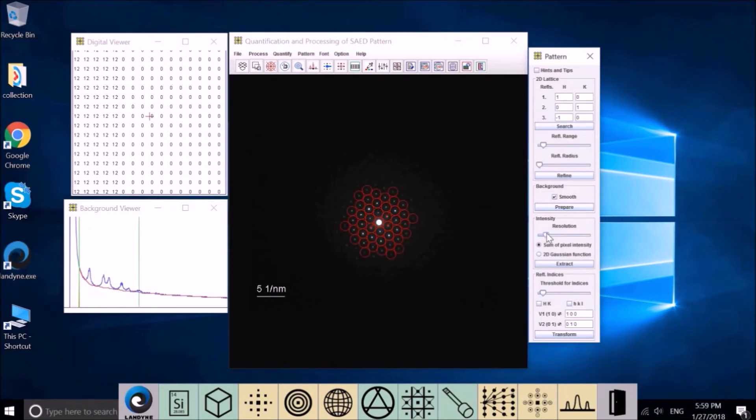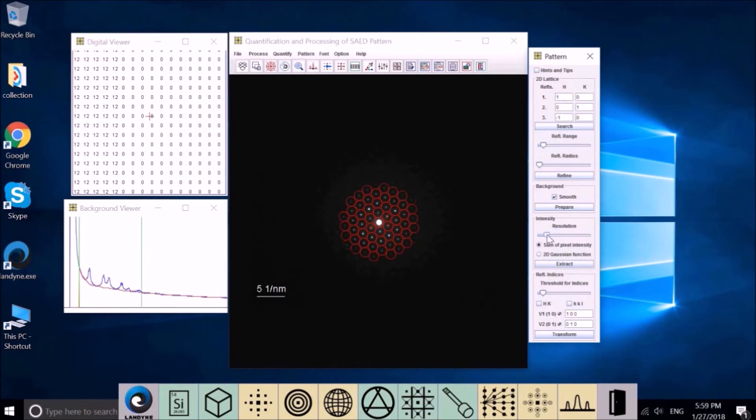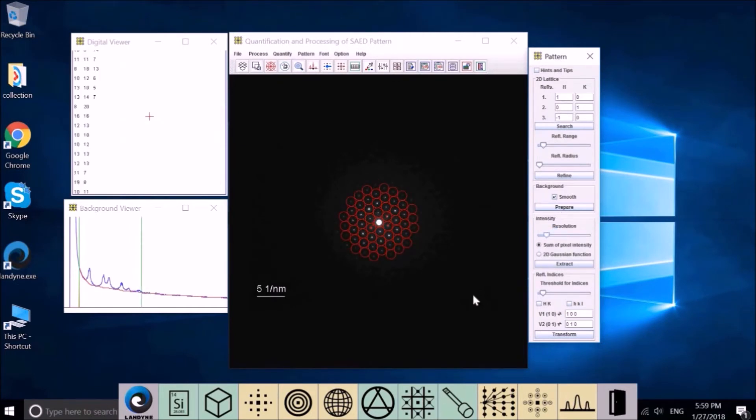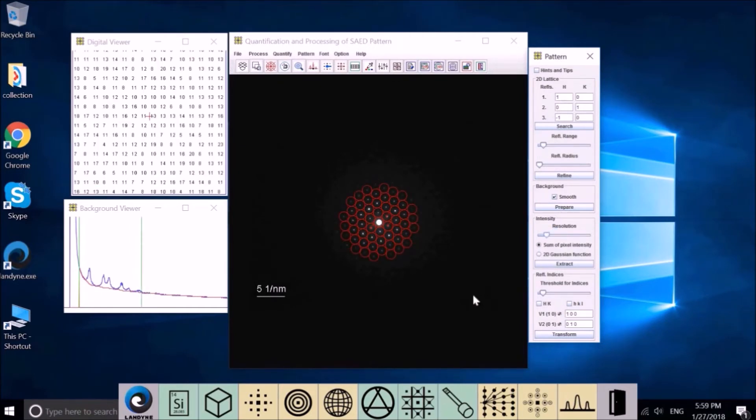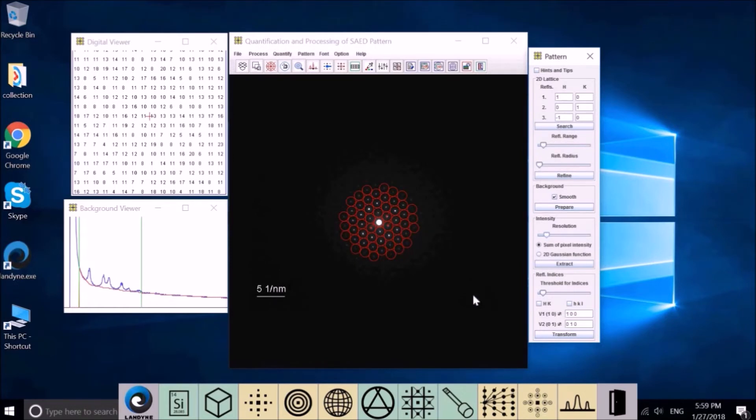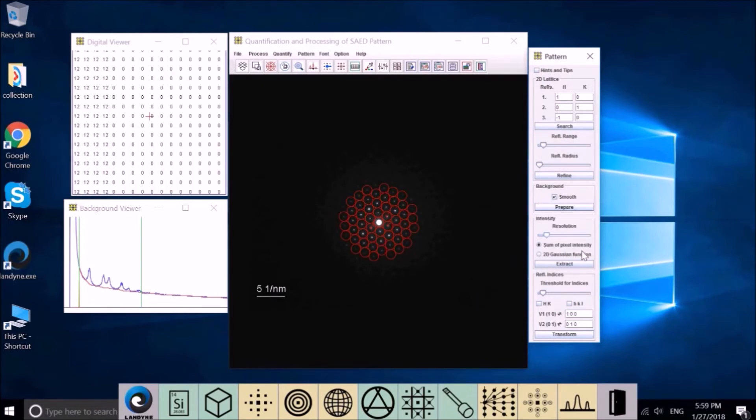We need to define the resolution first before retrieving diffraction intensities. Two methods are designed for unsaturated and saturated patterns, respectively.